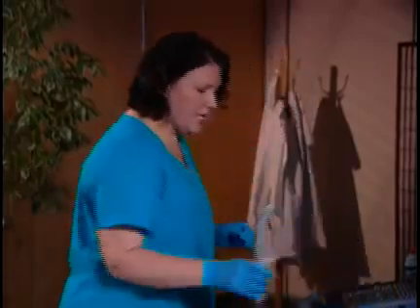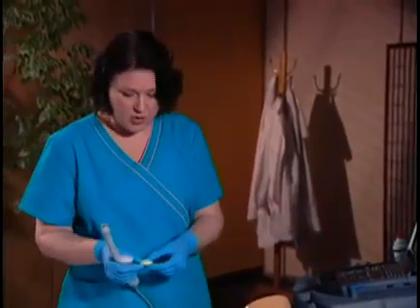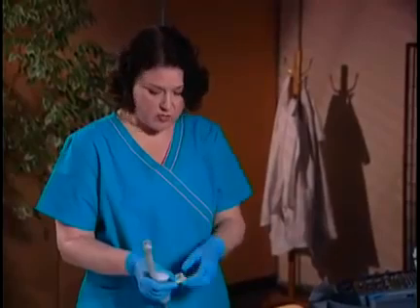So the first stage of the prep for the intracavitary transducer is that we need to cover it with a sheath. When you do this, we need to remove any air gaps inside the sheath next to the transducer face.